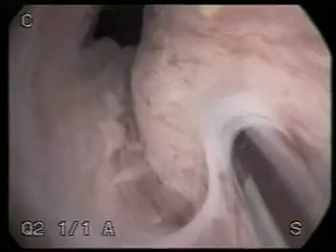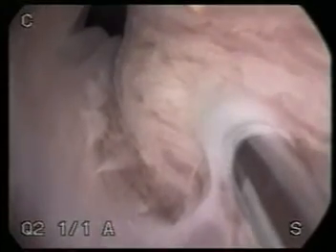Inject Durasphere into this site until the sac has crossed the midline of the urethra. Most sites will require more than one syringe. Excellent partial closure is seen. In order to achieve more complete urethral closure, additional Durasphere material is injected at the 8 o'clock position.